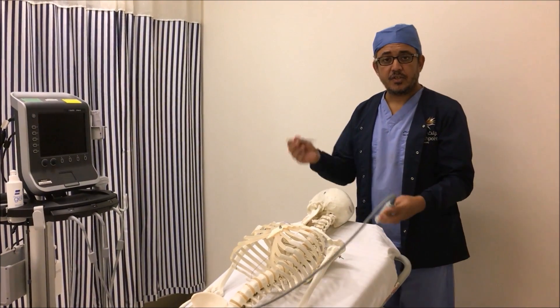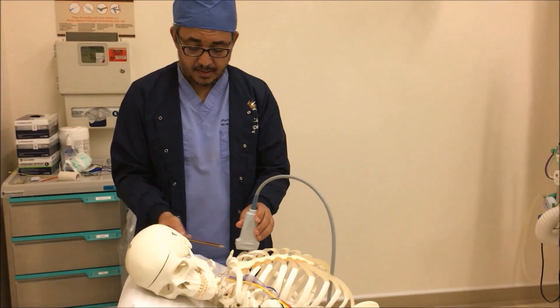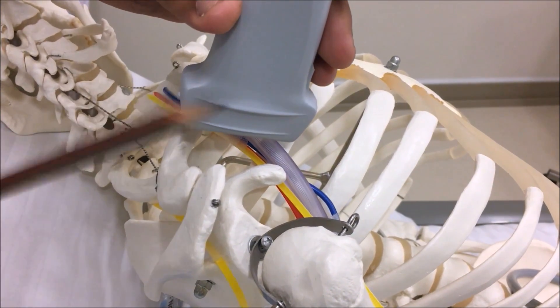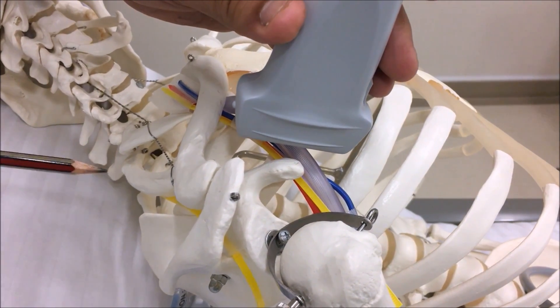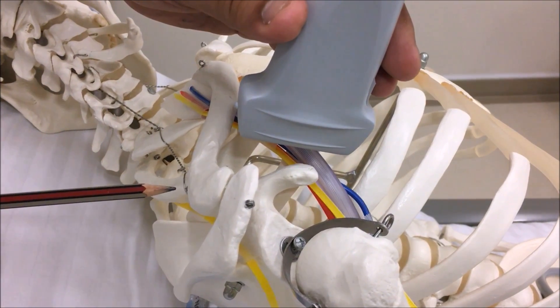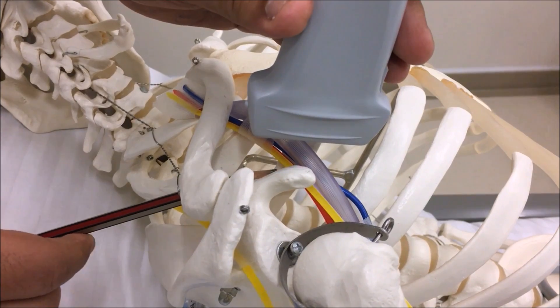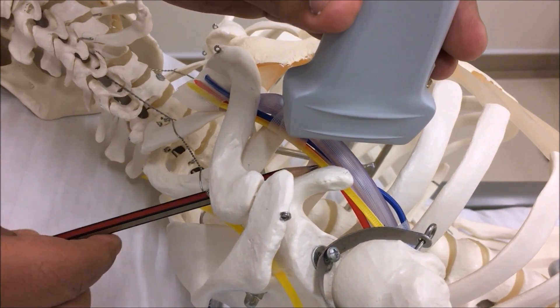This gives a better chance to use the right hand to hold the needle. For the posterior approach to the infraclavicular block, the ultrasound is placed inferior to the clavicle, and you try to get the best picture of the brachial plexus. The needle advances superior to the clavicle, about one and a half centimeters, and then passes deep to the clavicle, or posterior, toward the brachial plexus. In this approach, the needle is almost horizontal, giving very good needle resolution.